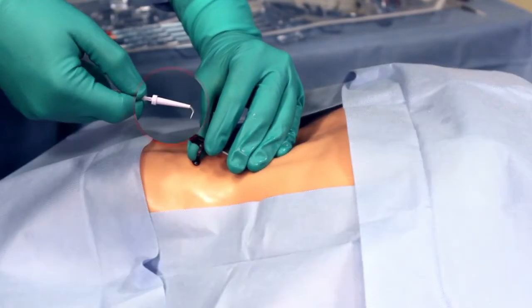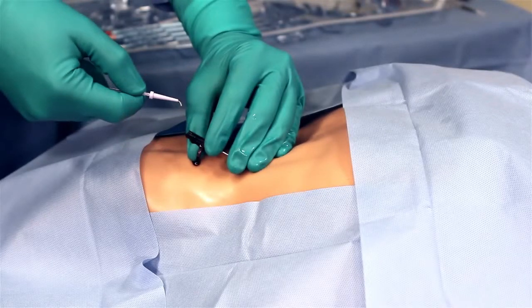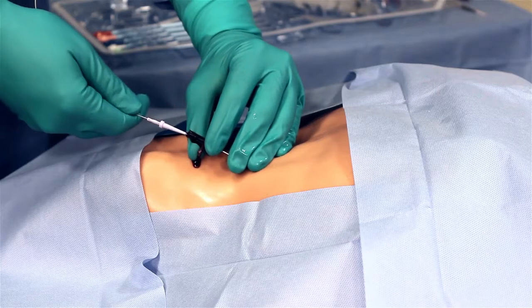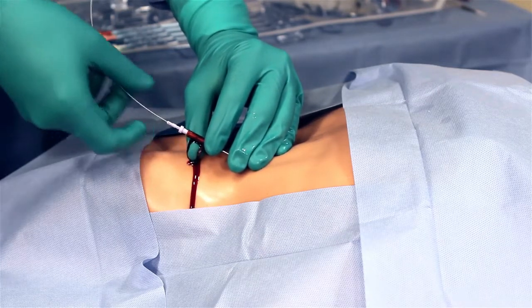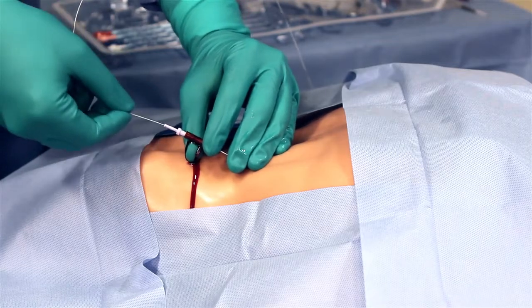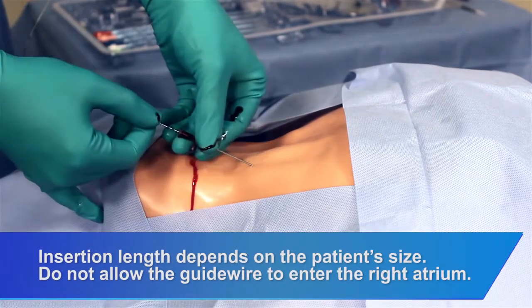Slide the J-tip end of the guide wire back into the advancer so only the tip is visible. Insert the distal end of the advancer into the needle hub. Advance the guide wire with a forward motion into and past the needle hub so that it reaches the target vessel. While securely holding the guide wire, remove the needle.